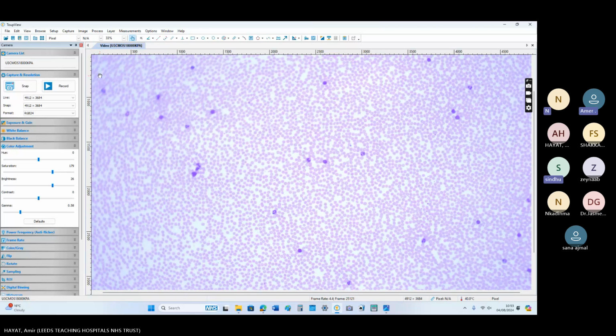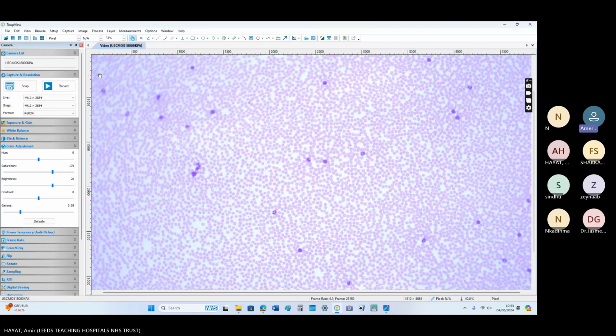Okay. Kindly tell the differential diagnosis of CML? So it can be a leukemoid reaction. It can be an AML. It can be a CML. It can be a CNL as well. So you give 3 or 4 differentials, that is fine.